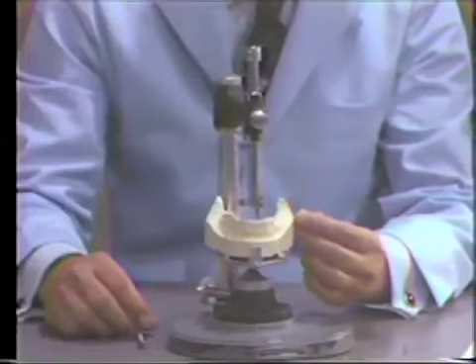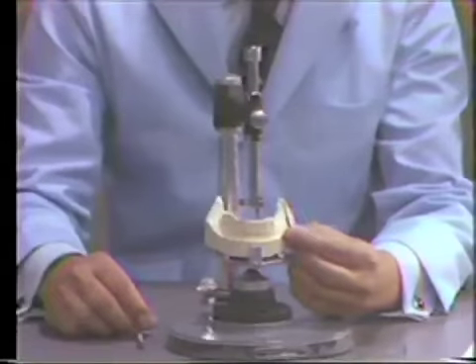The undercut gauge is so designed to tell me if I have the amount of undercut that I need. We see that the most inferior rim of the gauge is of a wider diameter than the shank of the instrument. And this distance in this particular gauge is 20 thousandths.